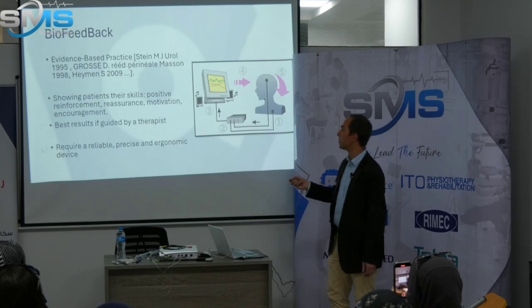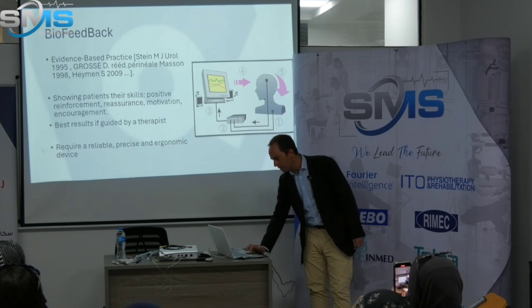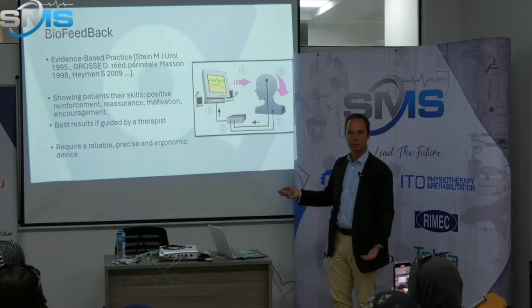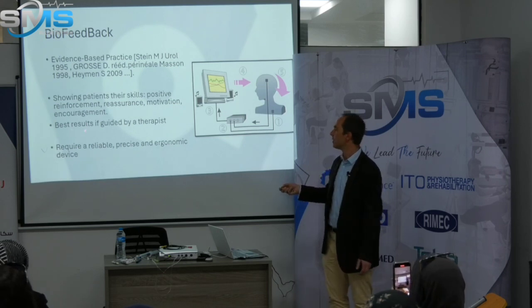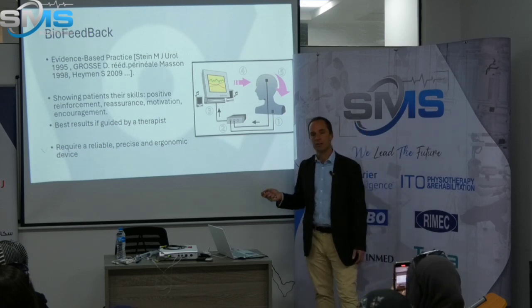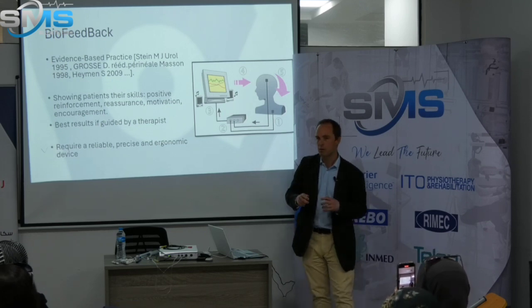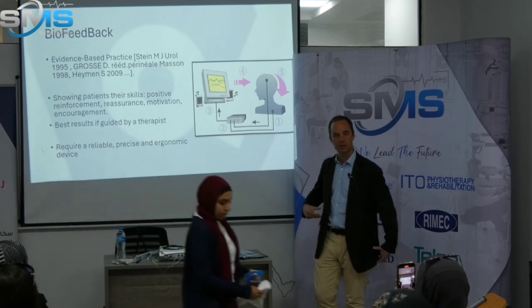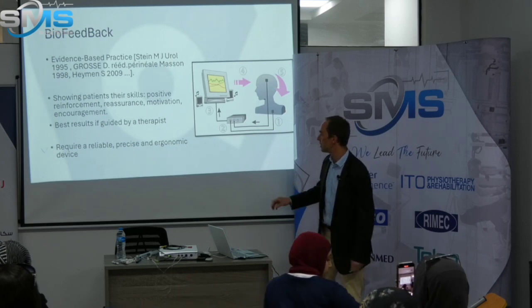Here again, it's an evidence-based practice. There are many documents. And one important point is that it can work. There are some home-used devices, but some studies show that we have best results if you are guided by a physiotherapist, because when you're doing things alone, sometimes you could have bad postural adjustment, bad parasite contraction, and so on, and you cannot see it if you're alone. That's why it's much better to work with a therapist.